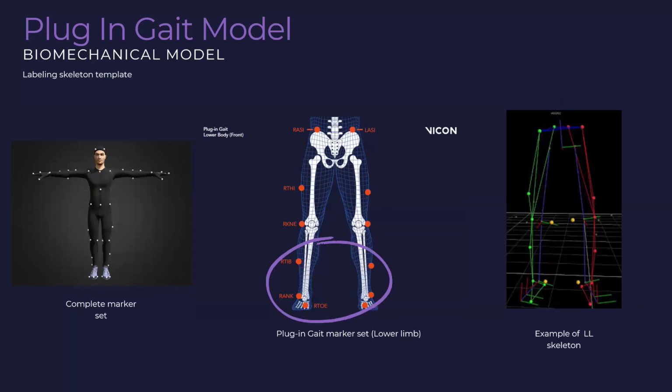Here, you will determine what gait phase you're in solely based on a model trained with inputs from the insole? The sole, yes. And I can also use the encoder and the actuator to have a better idea.